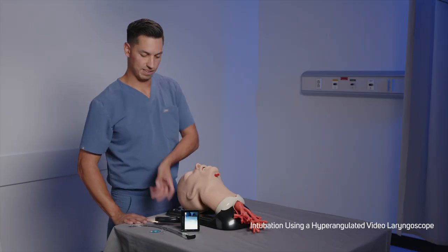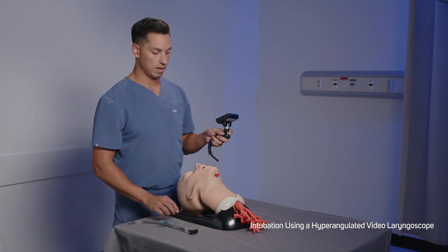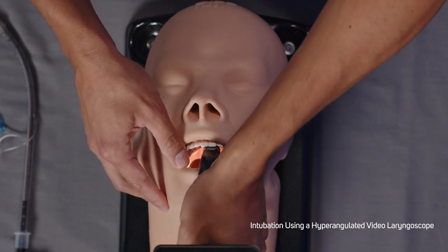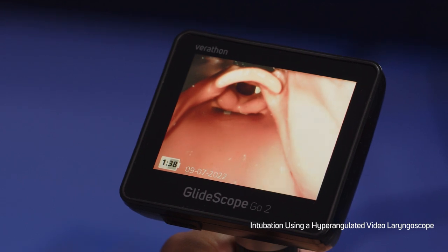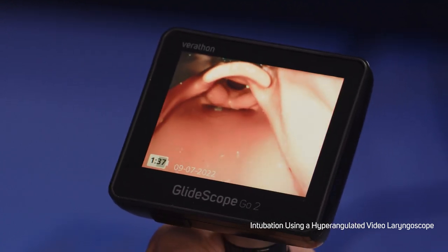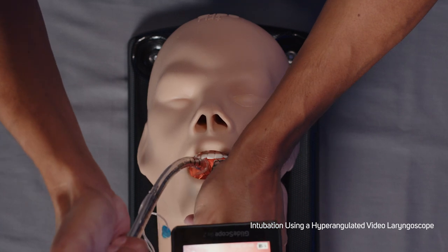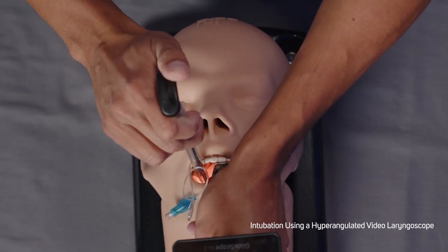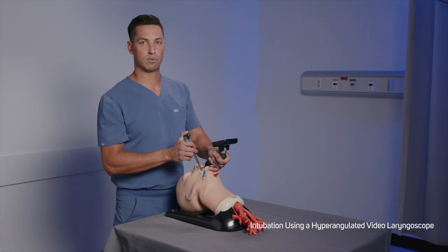Ensure you have the correct accessories for intubation: video laryngoscope and STAT if applicable, stylet, and endotracheal tube. Look in the mouth with the video laryngoscope in your left hand and introduce it along the midline of the oropharynx. No lateral displacement of the tongue is typically required. Look at the screen, identify the epiglottis, and manipulate the blade to obtain the best glottic view. When the video laryngoscope is appropriately positioned, the glottic aperture is centered in the upper third of the video display. Look in the mouth and carefully guide the distal tip of the tube into position towards the tip of the laryngoscope. Do not look back at the monitor until the distal tip of the tube is no longer visible with direct vision. Look at the screen, complete the intubation, gently rotating or angling the tube as needed to redirect. Once the ET tube is positioned, hold the tube in place while the stylet is completely removed from the ET tube in an arc towards the patient's feet.